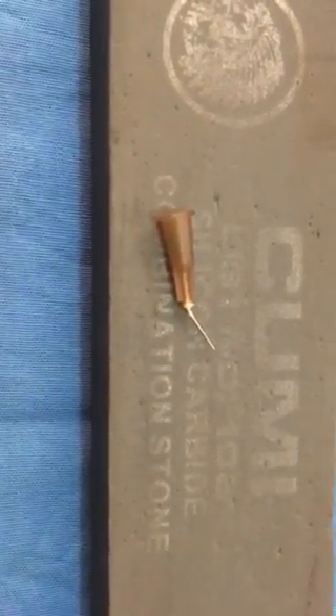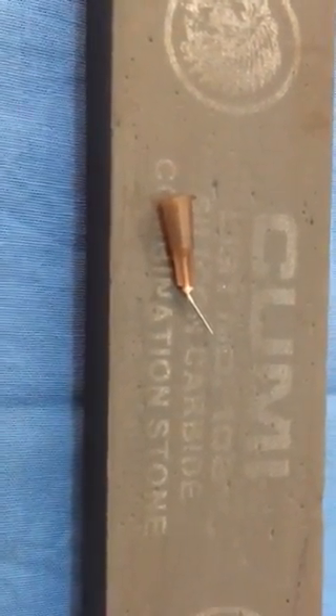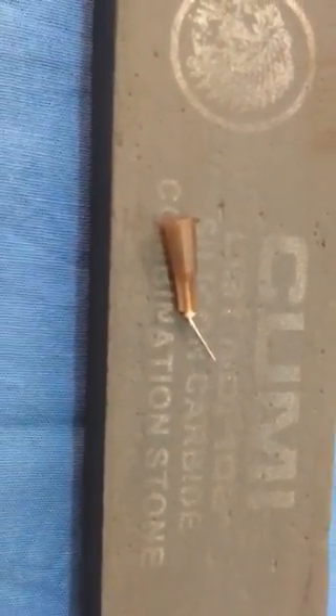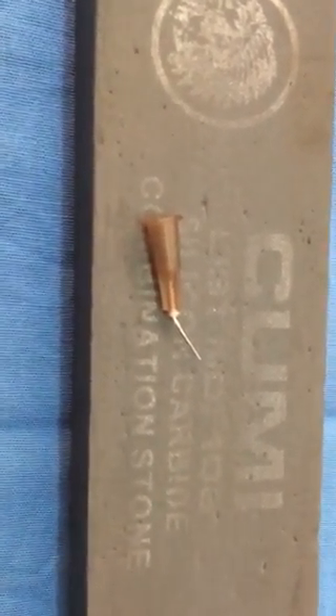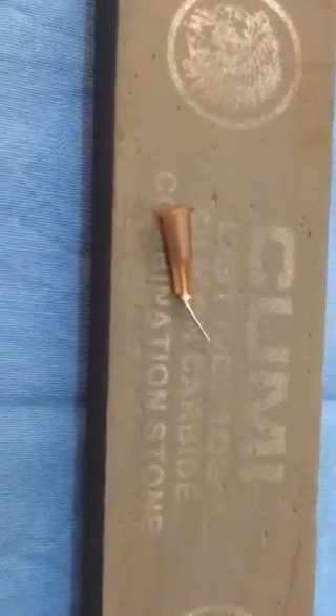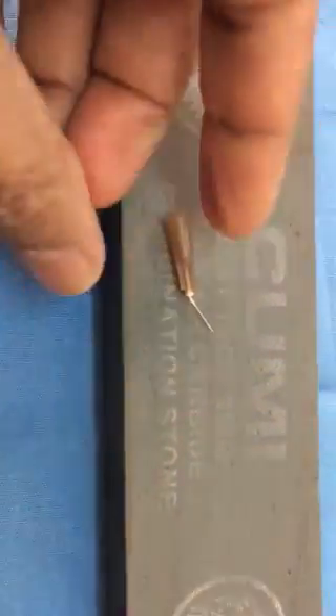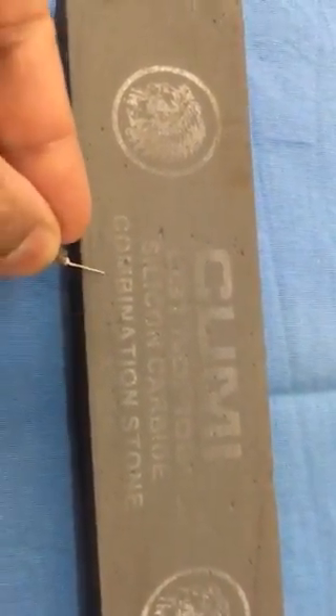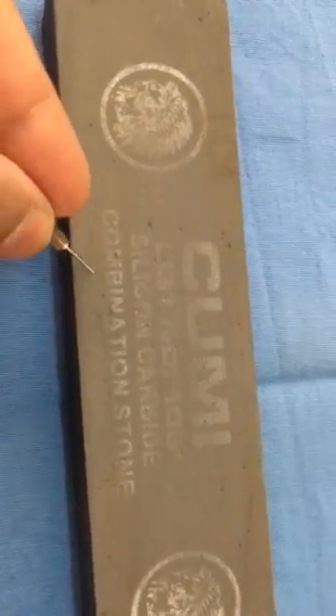To break the nucleus in the anterior chamber, we need a cannula which is very good, about 26 gauge. It should be strong and should not bend on pressure. That's the cannula I use. Even when you press something hard, it doesn't press. The commercially available cannulas are not as strong.